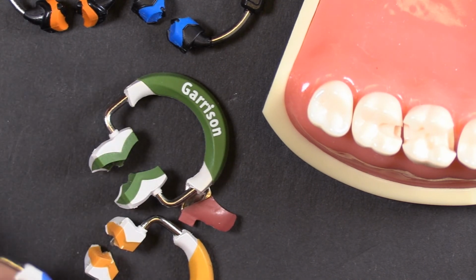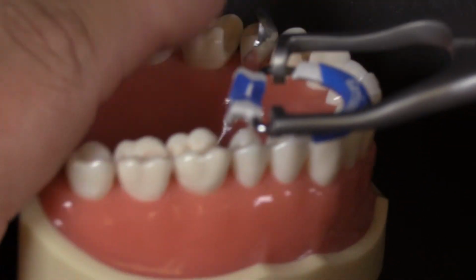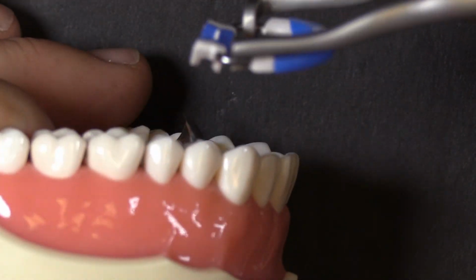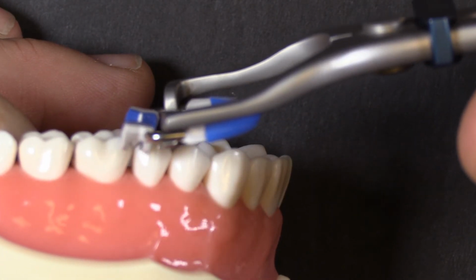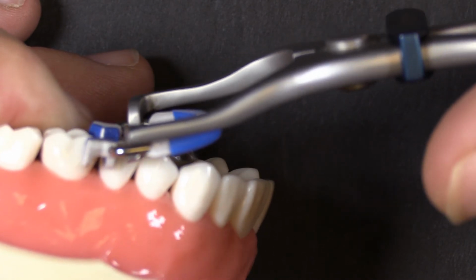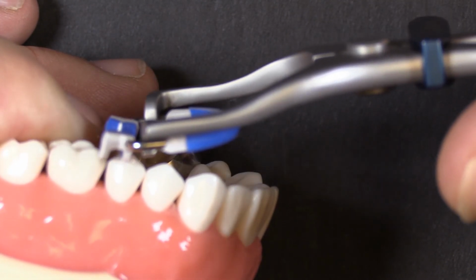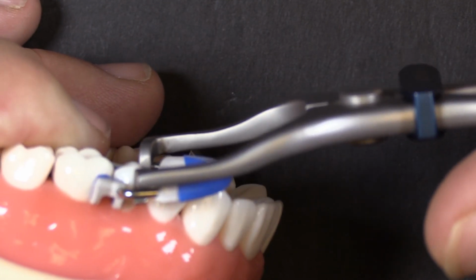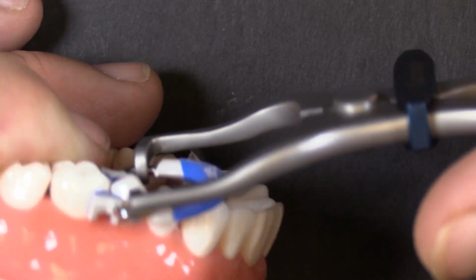With these types of rings, I'm going to tip this up here so we can see what I'm showing: you do not want to come in and try to come straight down on your placement. What happens when you come straight down is you'll grab the band, push the band down, and crumple the band as you're trying to place the ring.